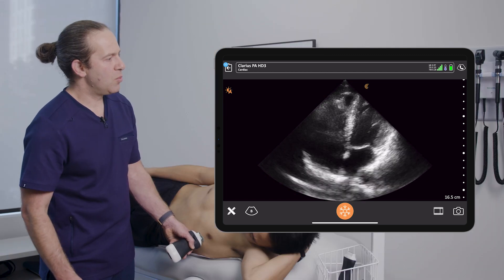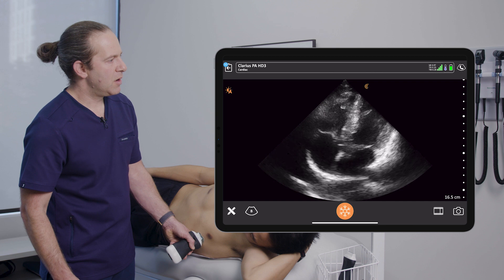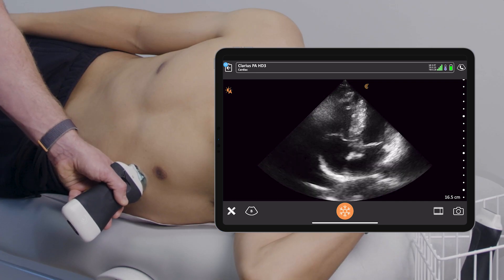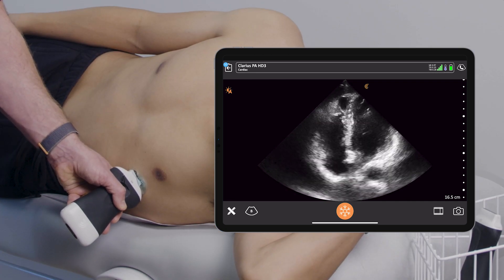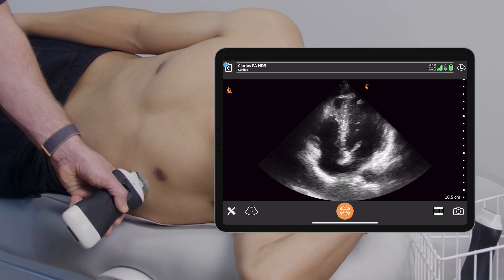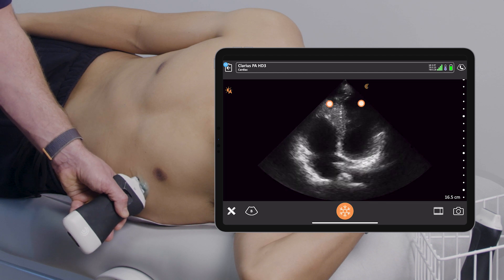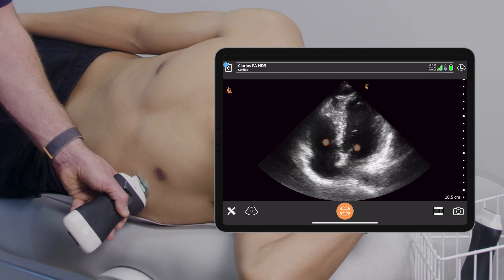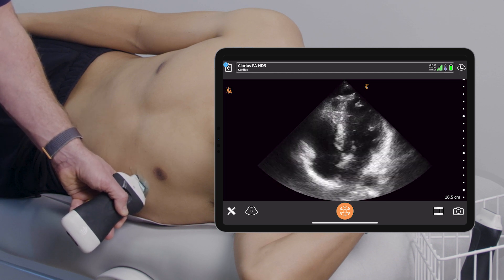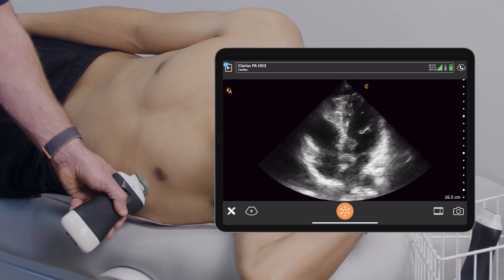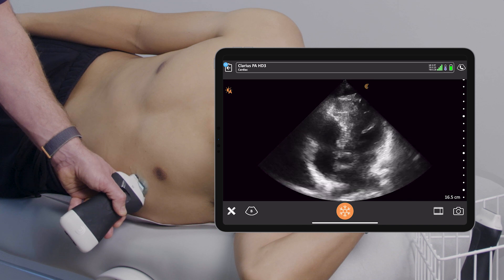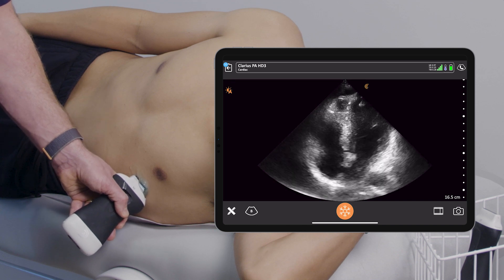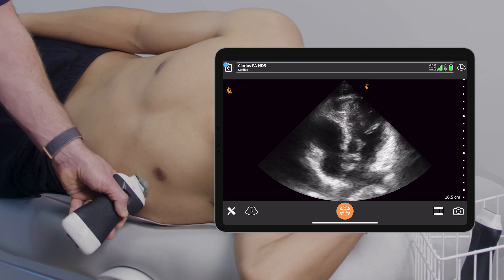Once I see the heart where I want it, I'll try and line up those ventricles as vertical as possible by tilting the transducer and maybe sliding it to get them right in the middle of the screen. It's really critical that I don't foreshorten the ventricles, meaning that I get them at their longest possible view I can generate.